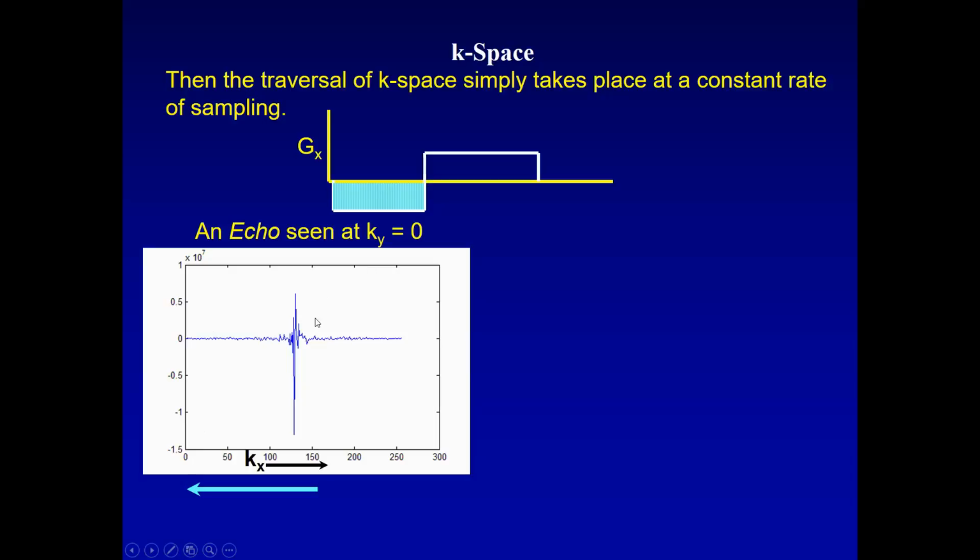In terms of the spins, it assigns a different frequency for each of the spins in the sample, depending on where they are, and it causes them to go out of phase. They start out all together when they tip into the XY plane, and then based on their location, rotate away from where you would see them in the rotating frame. And they get all spread out.